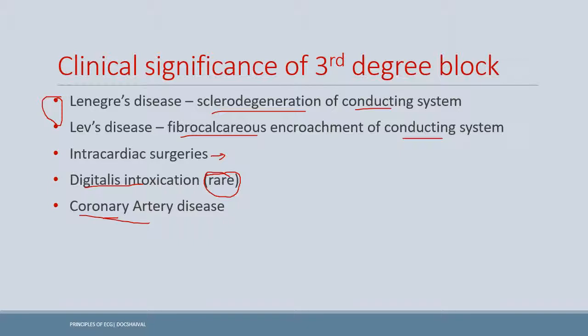And usually if there is an AV block complication, the third degree AV block complication in the MI, then that has a worse prognosis. Okay.